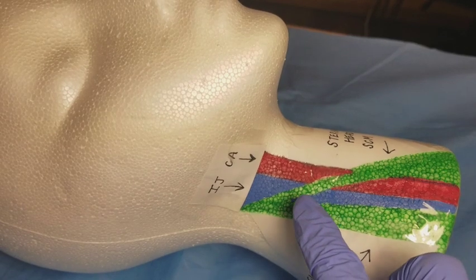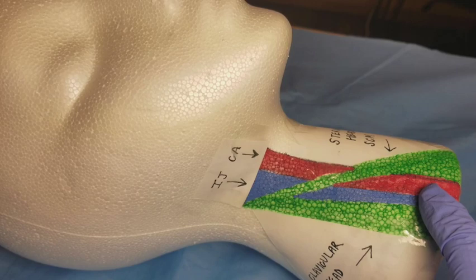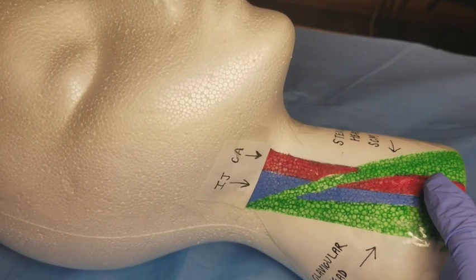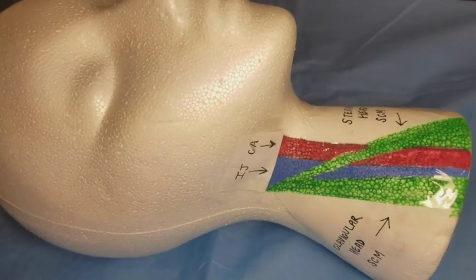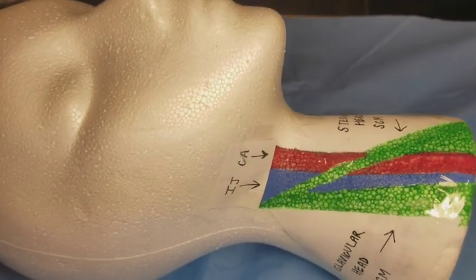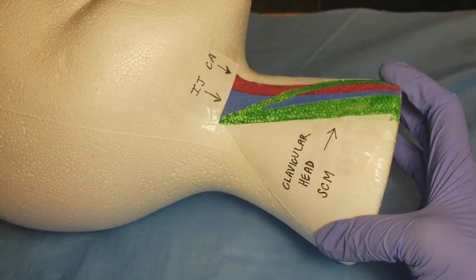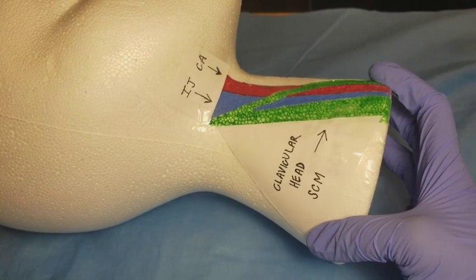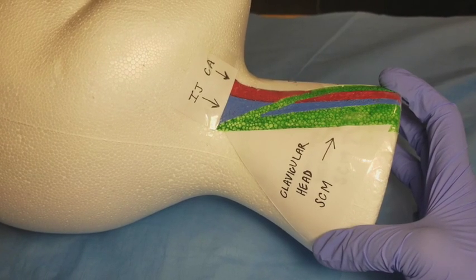So like I said, the apex is the internal jugular vein. Medial to that is the common carotid artery. That's what we don't want to nick, okay? Now, when we do this, you want the patient turned towards their left. The head is lower than the feet. This prevents air embolism and allows for vein engorgement.